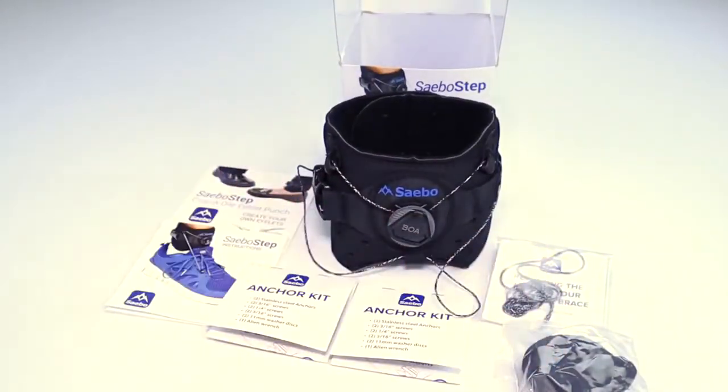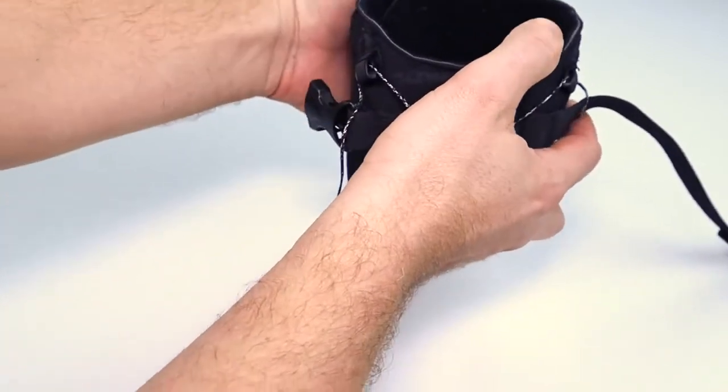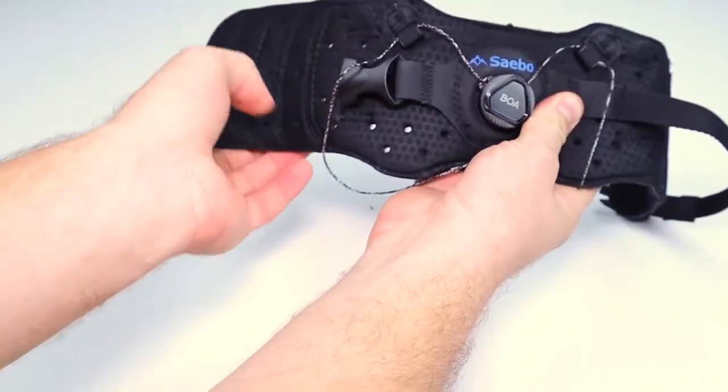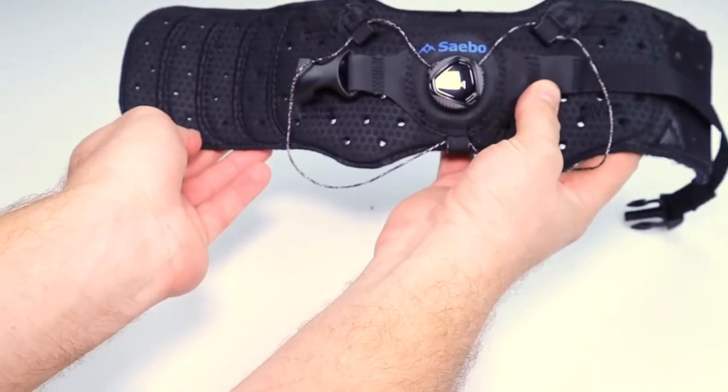Here is your Sabo Step. When opening your Sabo Step, undo the clip that adds extra support to keep this around your ankle. Then undo the Velcro. When you undo the Velcro, you'll see all these different panels. You can cut the fabric to make this a customized size for you — it's a one-size-fits-all.